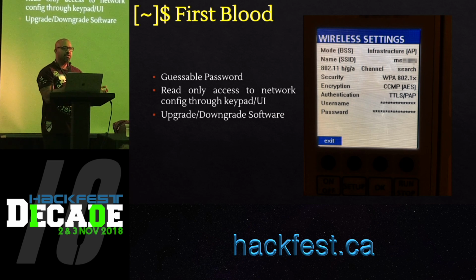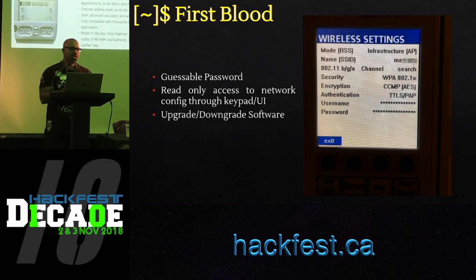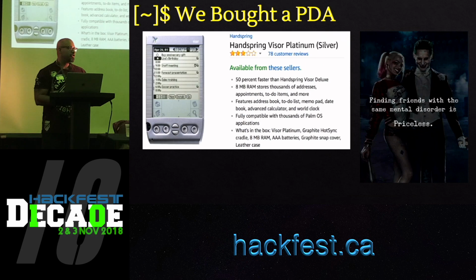So we remembered that there's an IRDA port that is exposed, so we took the obvious next step. We went on eBay and bought a PDA. The idea behind buying a PDA was to get it to talk to the infusion pump over IRDA. We brought it back to our lab, tried to make them connect to each other, and it just magically worked. There were no questions asked.